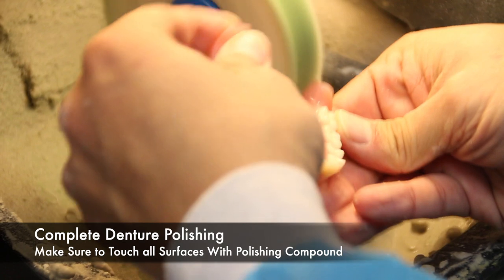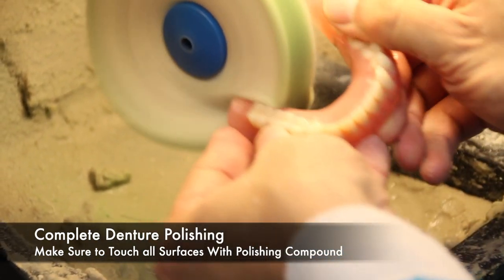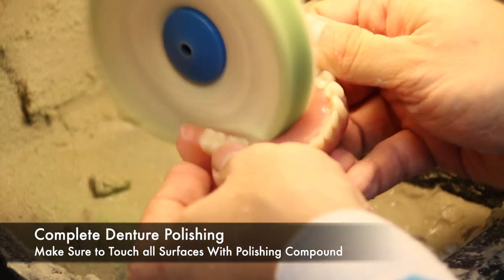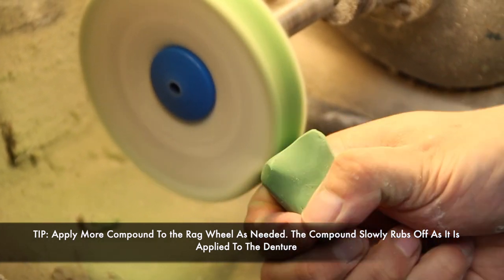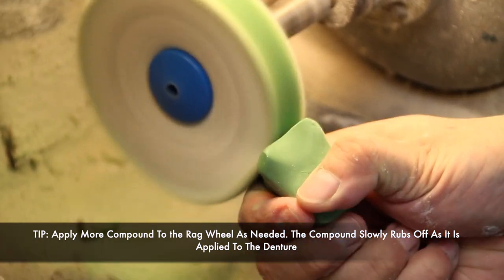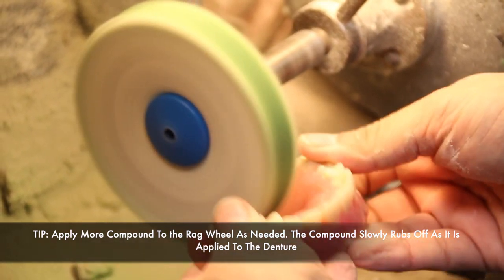Make sure that the polishing compound touches all the surfaces of the denture, including the borders. When using a polishing compound, apply more compound to the rag wheel as needed. Remember that the compound slowly rubs off as it is applied to the denture.